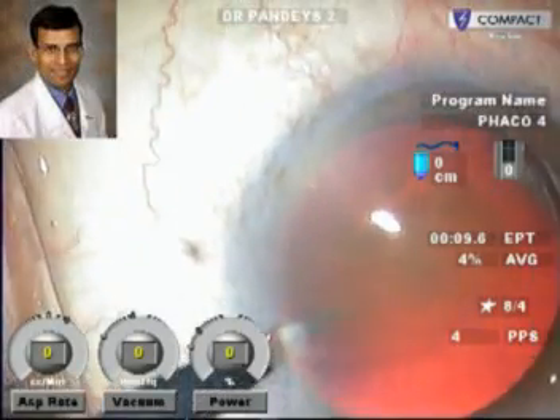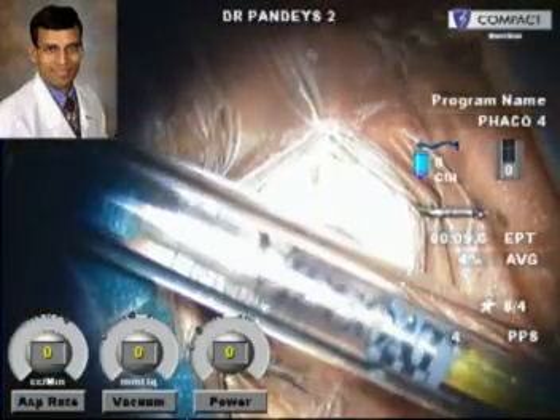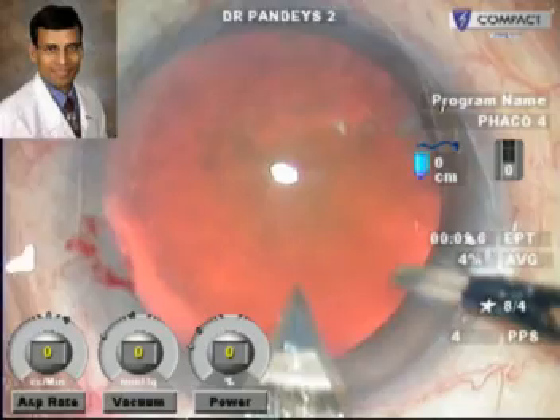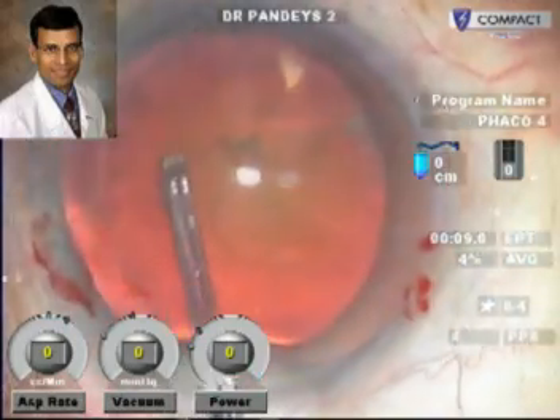As you can see here, this is a routine phacoemulsification being performed. We prefer to use a dispersive viscoelastic like Viscoat to coat the corneal endothelium routinely for all our phacoemulsification surgeries.